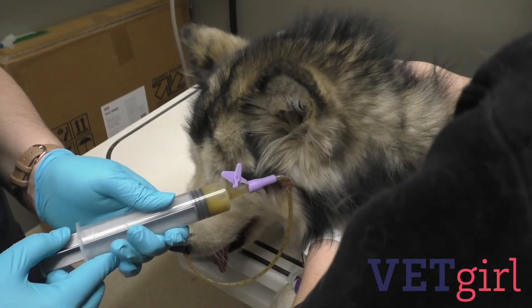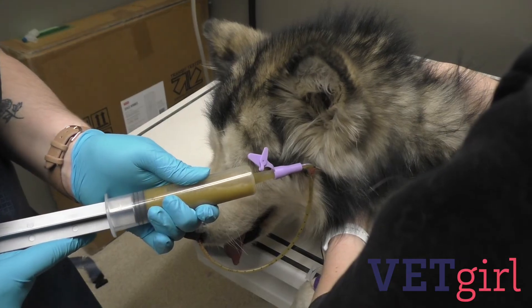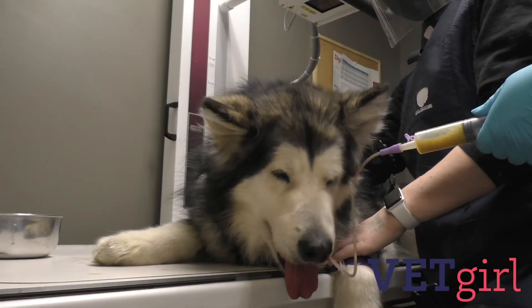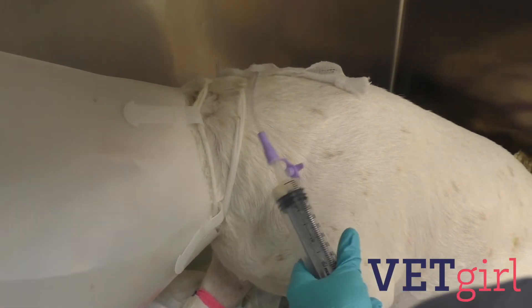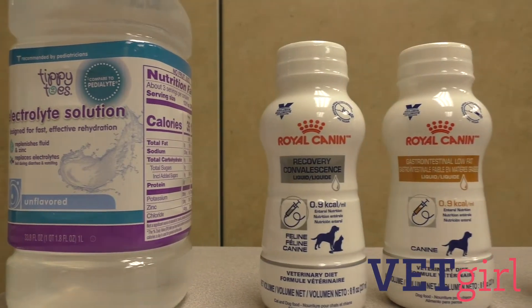As a general rule, suction the tube at least every four to six hours to evaluate the patient's gastric motility and emptying. Once the patient is stable, is no longer vomiting or nauseated, and has normal physiological parameters like temperature, blood pressure, perfusion, gut sounds, etc., you can begin with a quarter of the RER and gradually increase the rates as tolerated slowly.